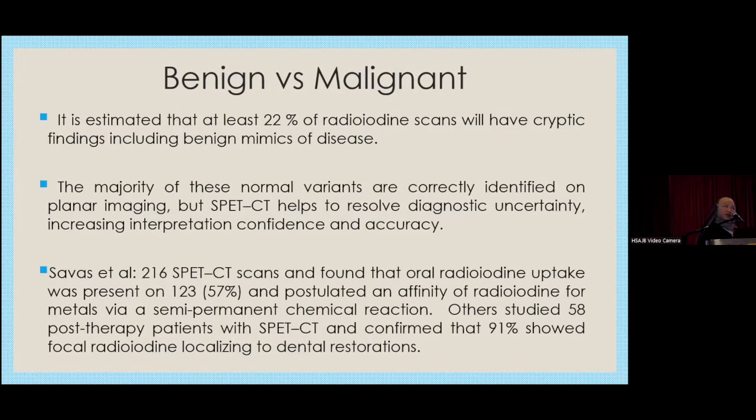So we had an experience where a patient had a maxillary uptake and we had the opportunity to do SPECT-CT. If we didn't have that, we might say that it is uptake in the oral cavity because of the dental plug or whatever. But because of SPECT-CT, it turned out to be a solitary maxillary lesion. So it is really helpful to do SPECT-CT in those kinds of patients.